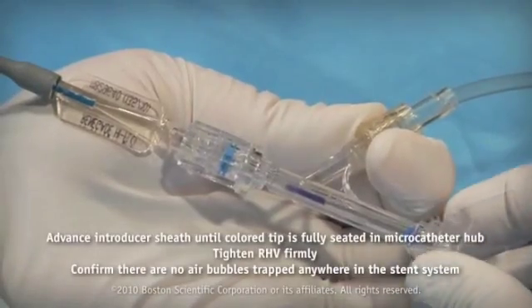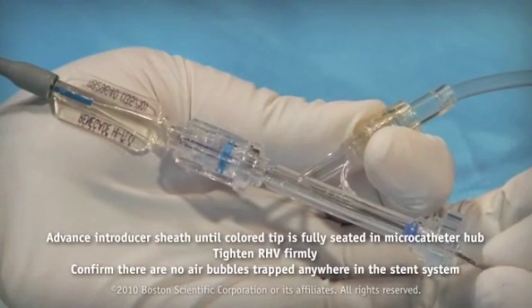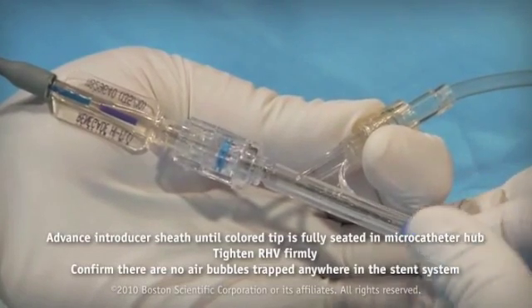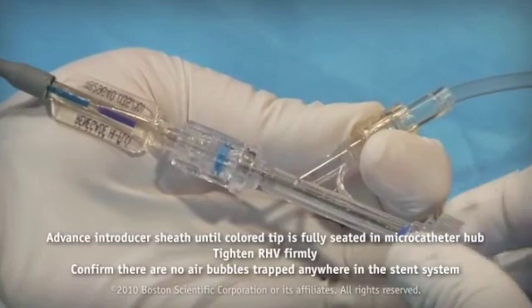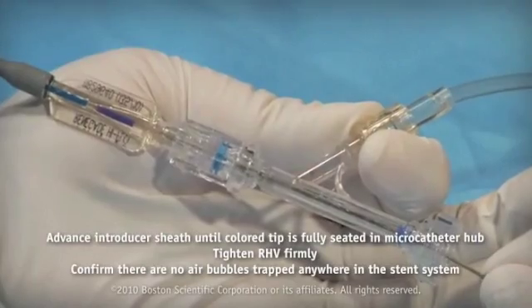Loosen the RHV. Advance the introducer sheath until the colored tip is fully seated in the microcatheter hub. Tighten the RHV firmly. Be sure to pull gently on the introducer sheath to ensure it is secure. The introducer sheath tip should not move.